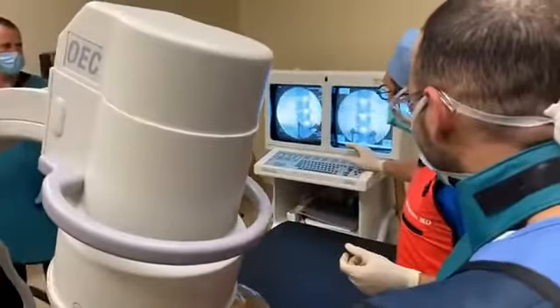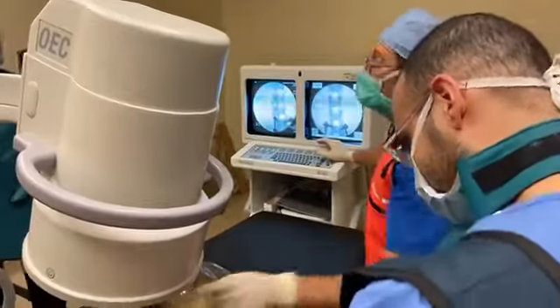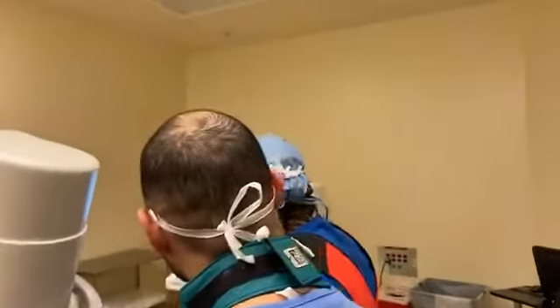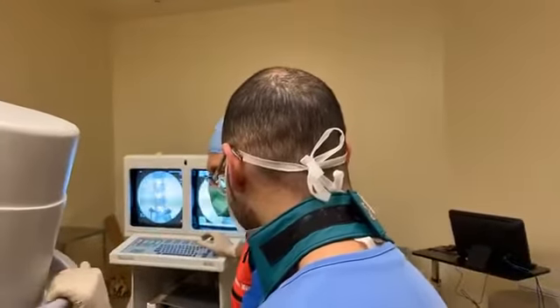Okay, so what bone are you hitting? There's two ways of knowing. One, you can look, but on X-ray you need more views. So let's save that, put it on the right. Now let's go AP.